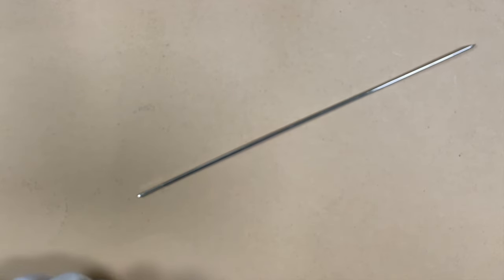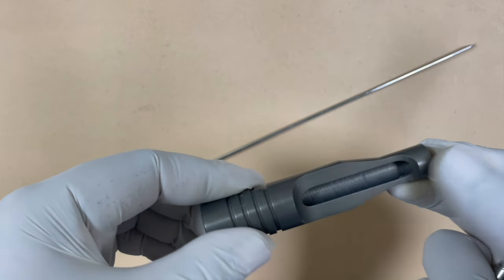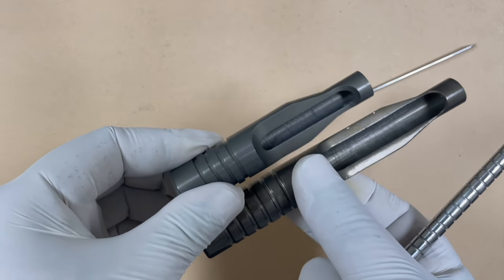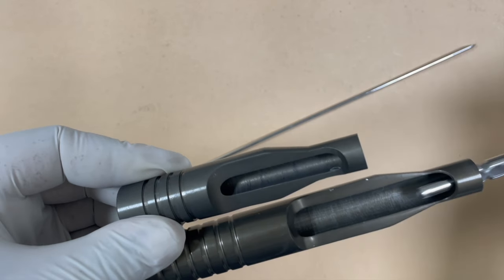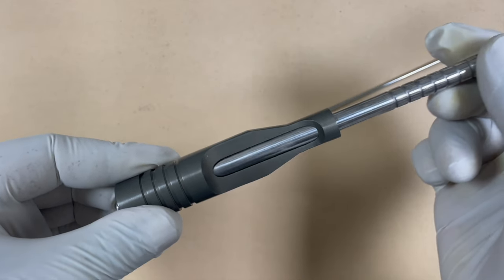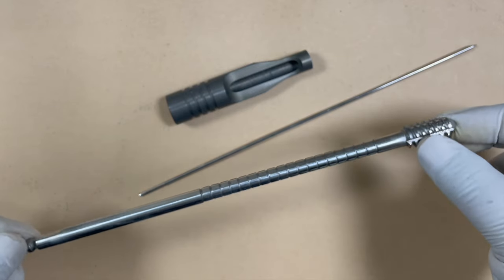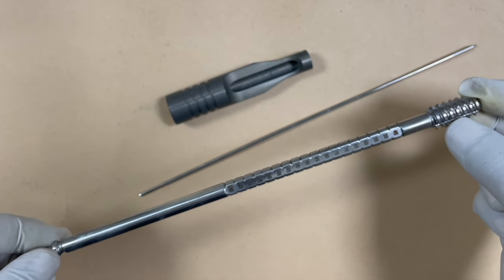The next step is tapping. For tapping you need the tap sleeve. There are actually two sleeves — one is for tapping and one is for screw placement. The narrower one is for the tap and the larger one is for the screw. The tap fits perfectly in the narrower sleeve. The terminal part of the tap is threaded and is made for cutting threads inside the bone.